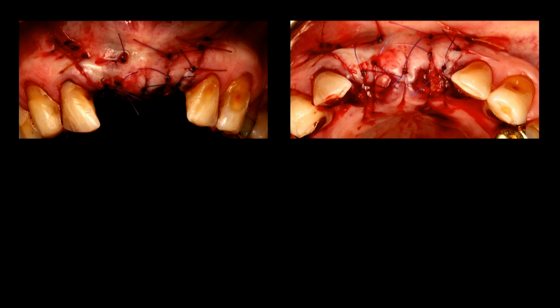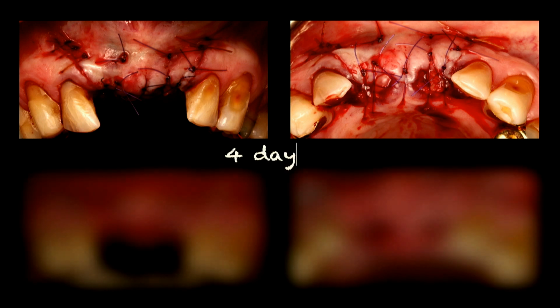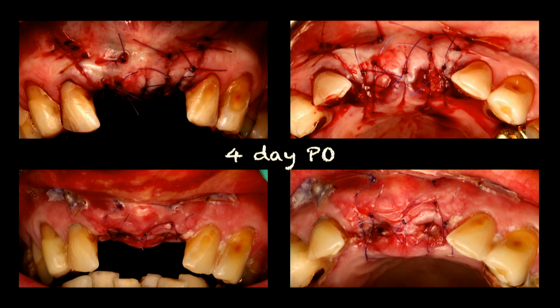So I didn't even attempt to get primary closure. I wasn't even going to force the issue because I know what properties BioXclude has. It can be left exposed. And you can't blame him for being 96 years old and coming on the wrong day, and I thought that would be a wonderful photo opportunity. So seeing that this 96-year-old has good healing 4 days out, not a pretty sight to him, but I appreciate the healing.